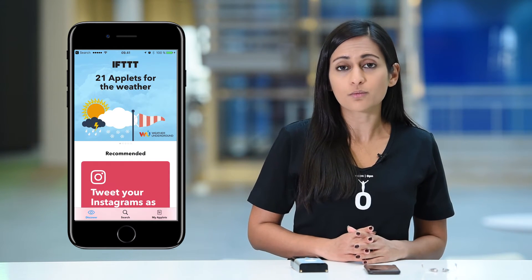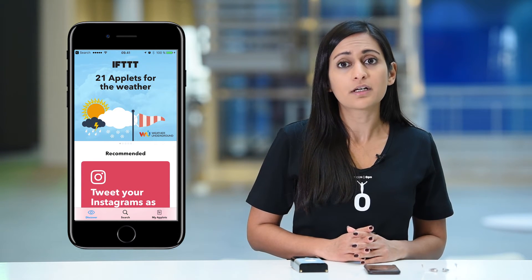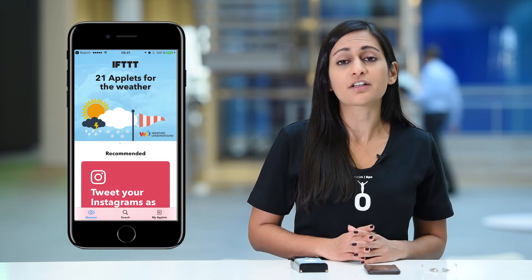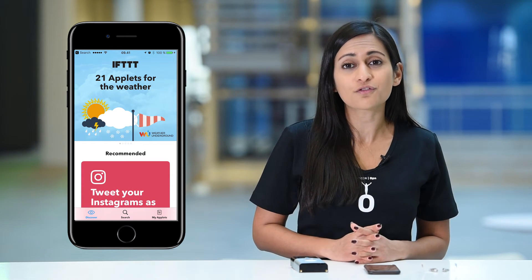Once the Ring doorbell is configured, we're ready to link everything together so that when someone rings the doorbell, a spoken notification is heard in the hearing aids. We just need to go back to IFTTT and complete the configuration. The first step is to tap My Applets at the bottom right part of the screen. This takes us to an overview of all the applets we currently have configured. Tap on the plus sign to enter the Applet Maker to begin creating your applet.